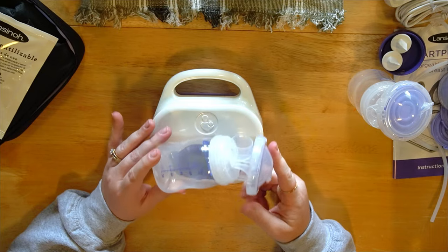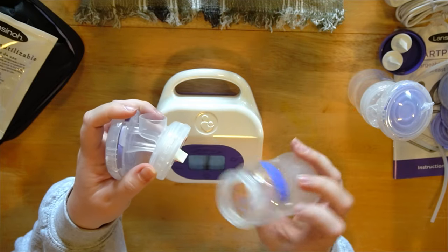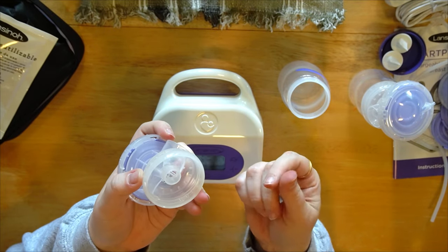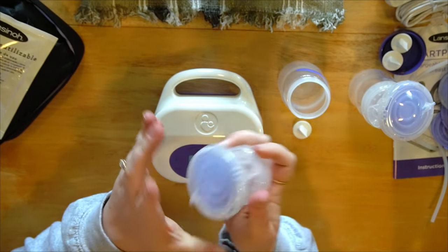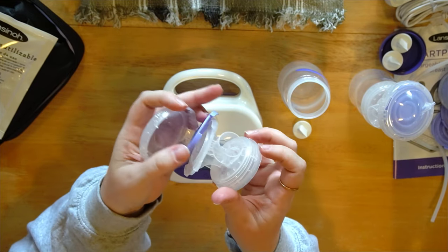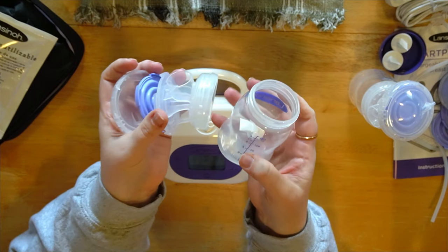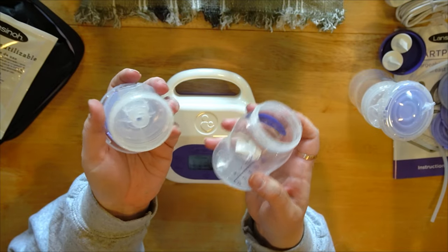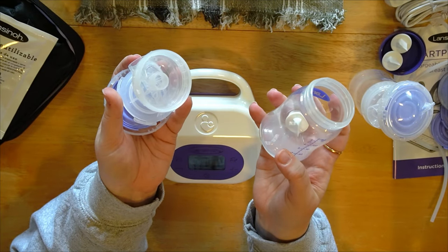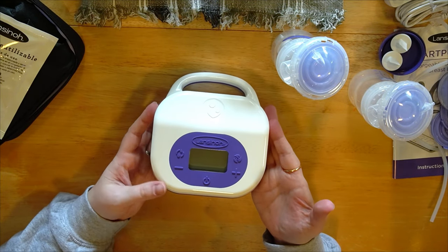I'll show you how to set this up because even though it comes assembled, you're going to have to take it apart. Unscrew the bottle — not from here but from up here so you don't damage those gentle little things. The lid up here twists off — just twist it to the left, lefty loosey — and you can take all of this apart. You would need to sterilize this before your first use: wash with soap and water, then sterilize.